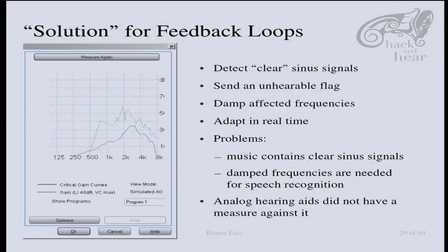The problem with that is that music contains clear sine signals, and those get damped, which makes your music experience a lot worse. And the damped frequencies can also be in the speech banana, which means whenever you put on a hat, you get a feedback loop, the frequencies get damped, and then you cannot understand anyone anymore.